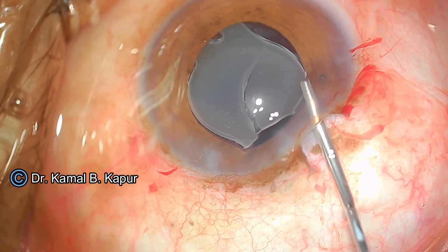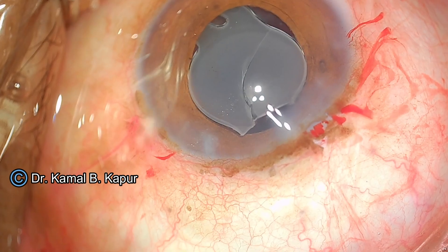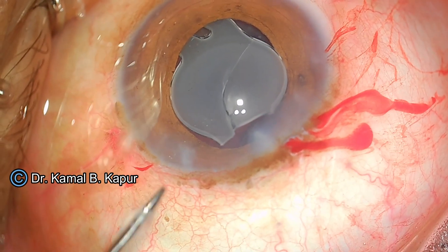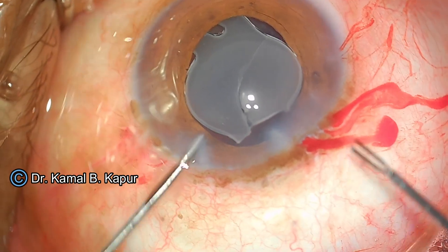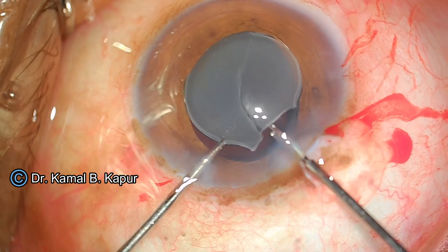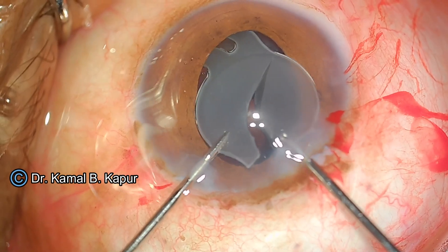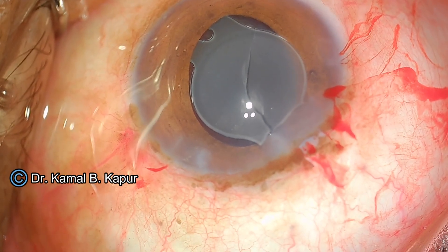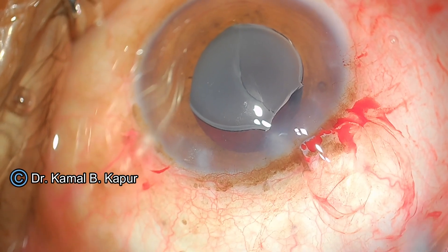I again push viscoelastic over the endothelium and sodium hyaluronate behind the IOL. I re-grasp the IOL with the hand grasping forceps and use ILM peeling forceps borrowed from my retina colleague to see if I can tear the lens and pull it out — but the lens is very tough and rigid and did not break.